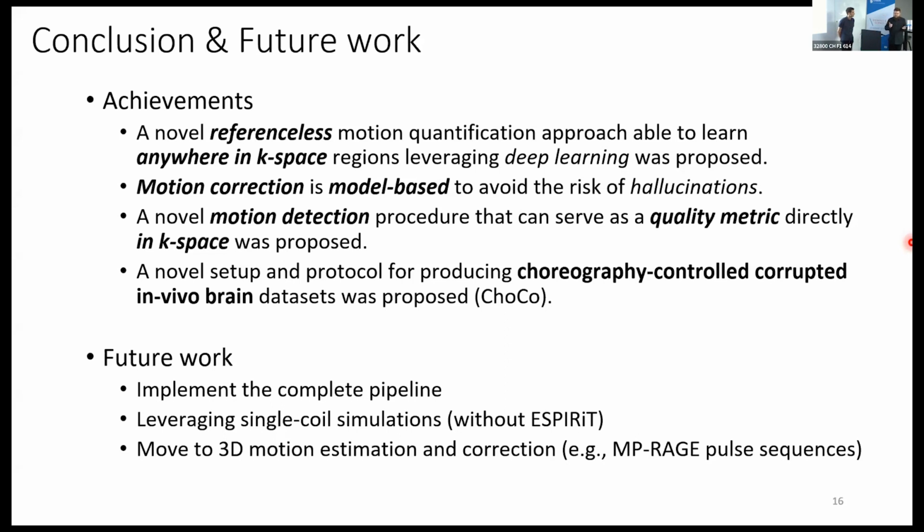We could try, because we give a neighborhood around the region of motion onset, so we could try to pad it with zeros and see how it behaves, whether it's able to leverage the information that's there. But otherwise, we would need to study and probably train the neural network to account for that, or at least do, for example, a machine learning enhanced GRAPPA or something like that. Thank you.